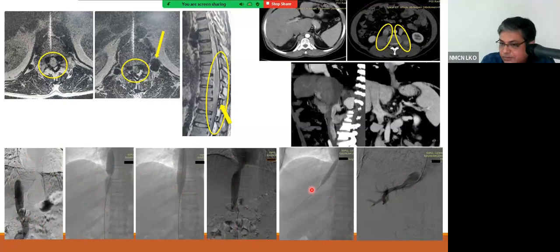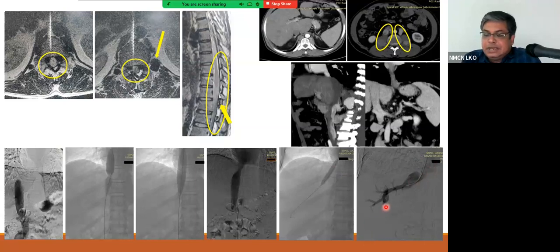As the patient was also having partial stenosis of the RHV, angioplasty was done there too, and we can see antegrade flow via RHV.